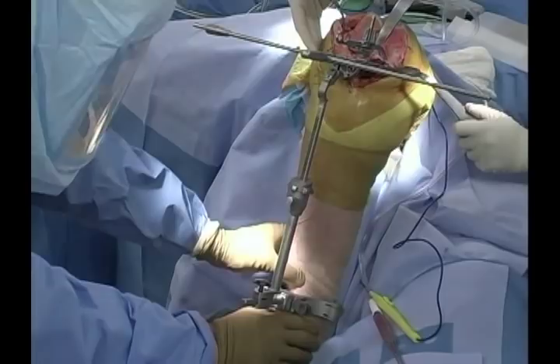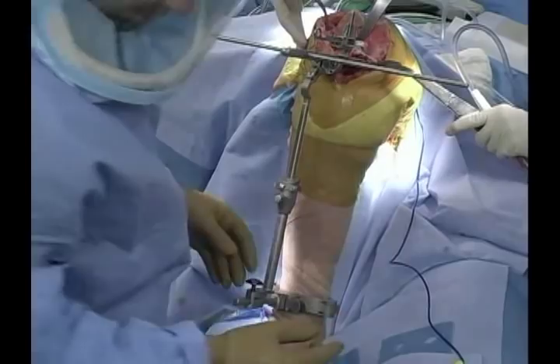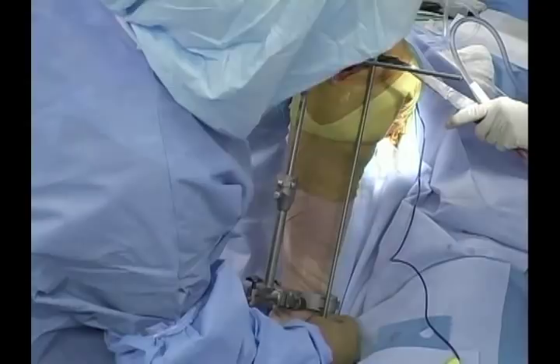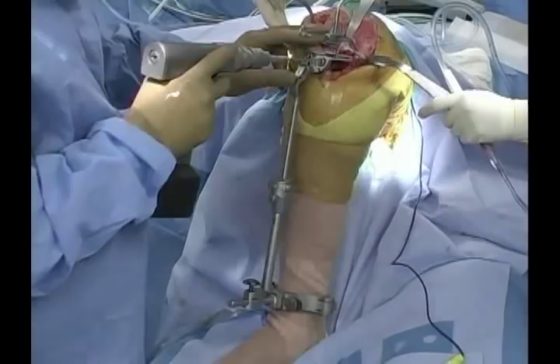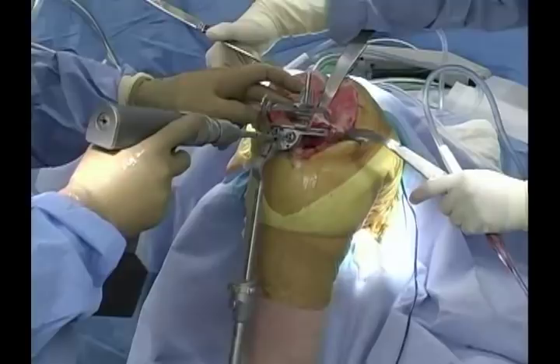I'm fairly happy with the orientation in the coronal plane. We'll look at sagittal alignment as well, going from the middle of the plateau to the medial malleolus. The guide should be set at approximately zero to three degrees for a posterior stabilized knee. Once satisfied with the block — depth of resection, rotation, coronal plane, and sagittal plane alignment — we pin the block in place.